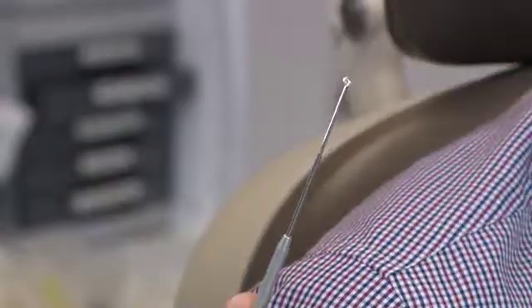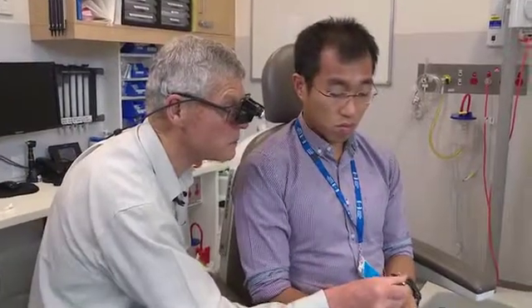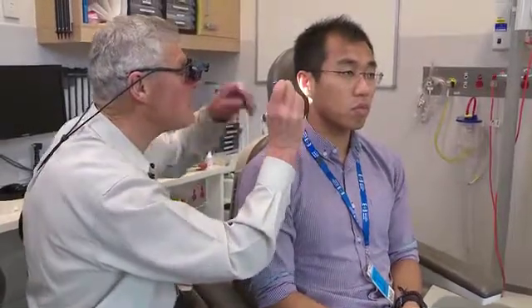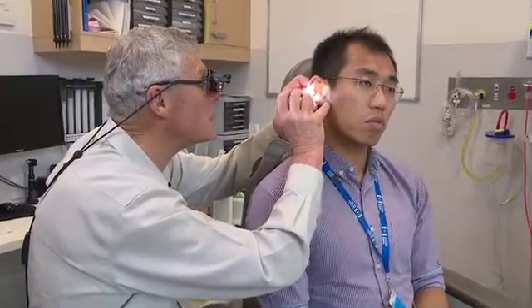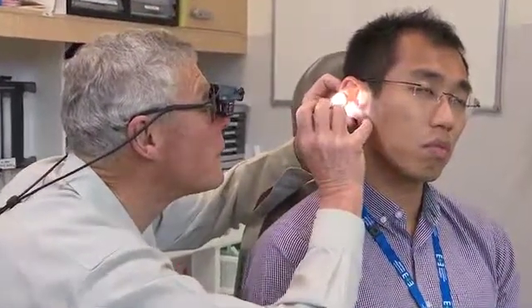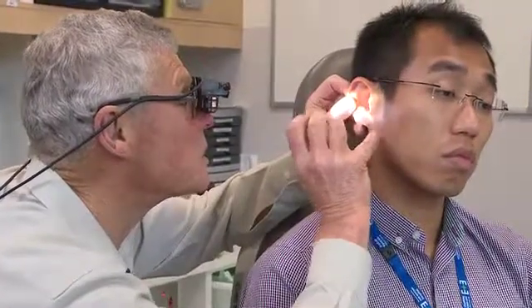It looks like this — metal end like that — and it feels like this, which you will do. And then before they've had much chance to think about it, in your ear it feels like this. It's probably a good idea to just do a little bit more and go around the meatus. That's where your finger would reach, so you know that's not hurting, and hopefully you've now got a bit of understanding from your patient, who might be a small frightened child.